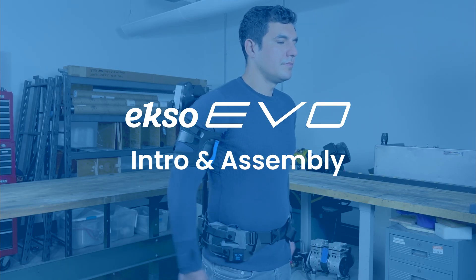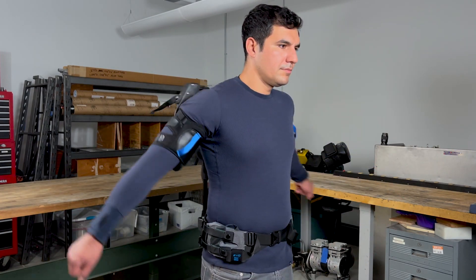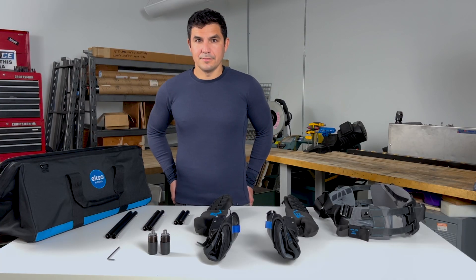ExoEvo is designed to fit ergonomically and naturally track your movements while improving endurance and reducing injury. If you haven't already, please take the parts out of the storage bag and lay them out in front of you.